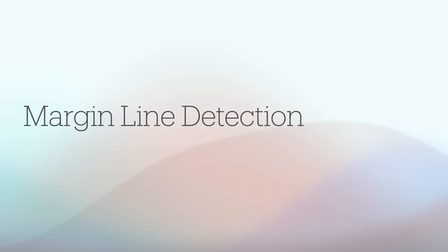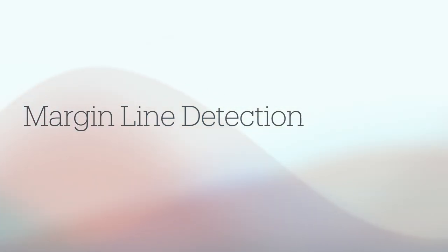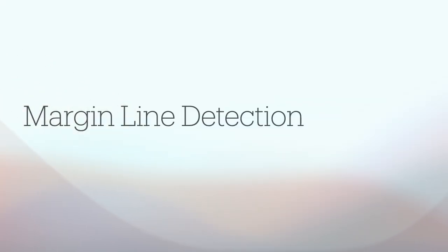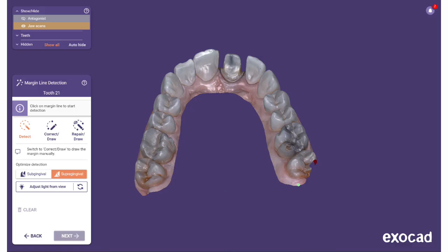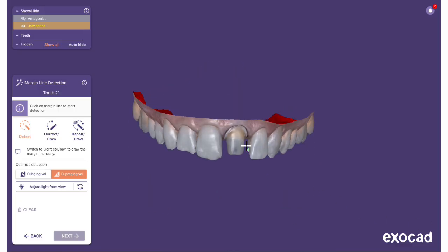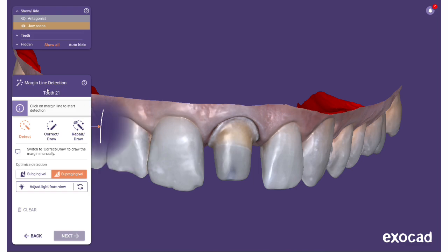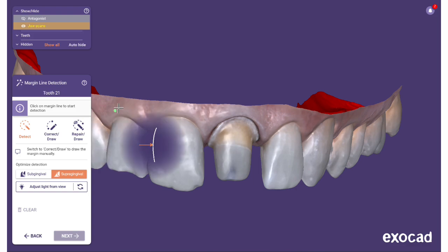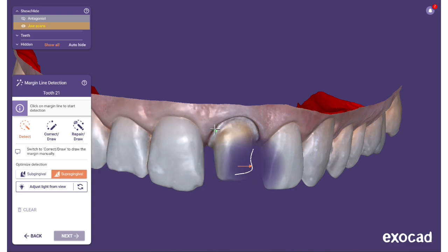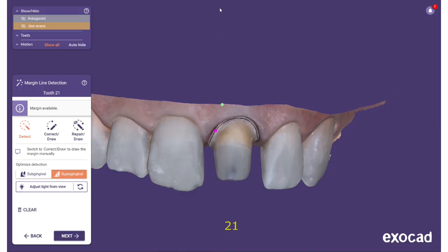The first step in the construction is the preparation margin detection. In most cases, the wizard will prompt you to define the margin line for specific tools. As you move the mouse over the scan data, a bubble will appear showing you a sectional 2D view of the area below the mouse pointer.